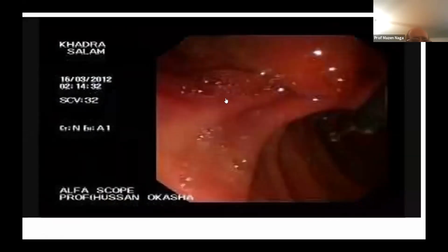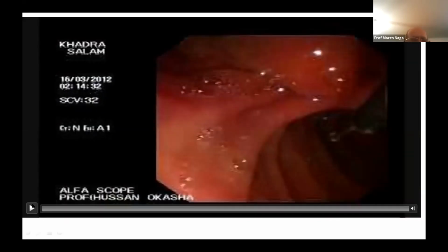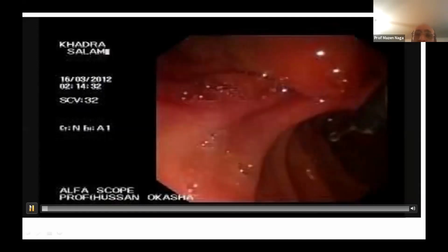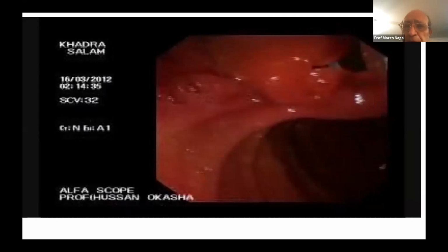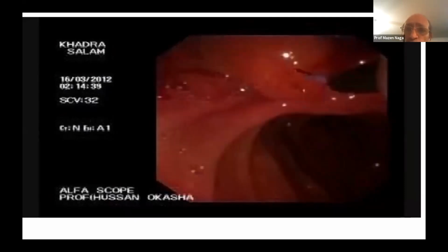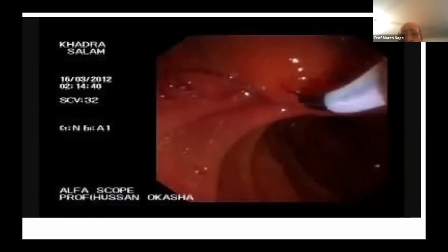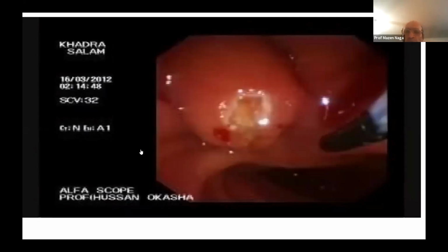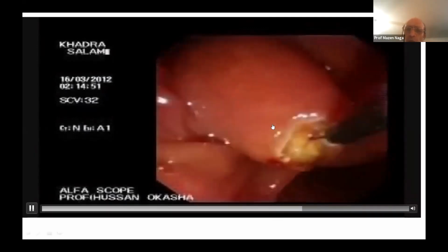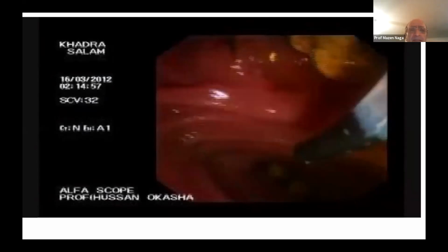This is another very easy example because this is a pregnant papilla with stones inside. The stones protect us from making perforation because we cut over the upper surface of the stone, and we cut the mucosa not so deep in the spot where we know there are stones inside, because this is safer. Now we find the white color of the muscle layer, and when we cut this, we will see the stones slipping one after the other outside the pregnant papilla.